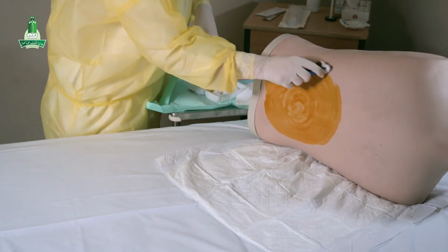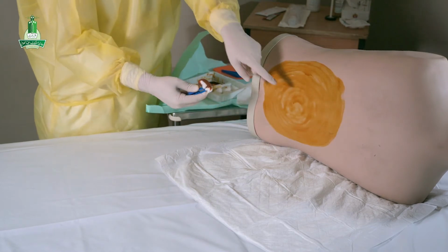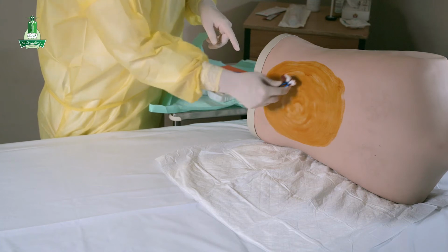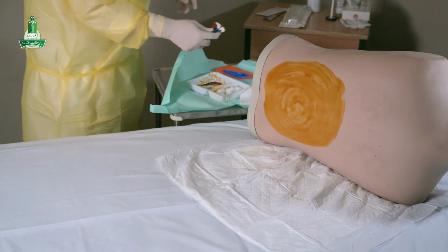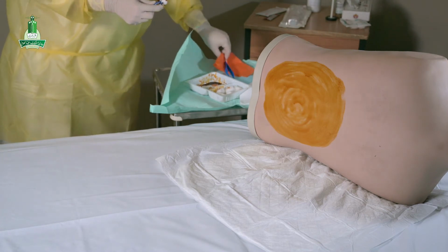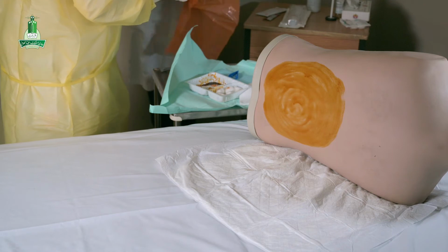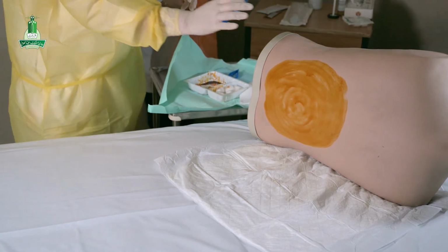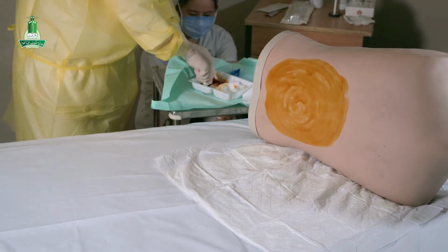So you should start from the center of the procedure area and then you go outward. And then let it dry for a few seconds. Can you open this large tray for me? Thank you. And now, after it dries, you should put the second application.